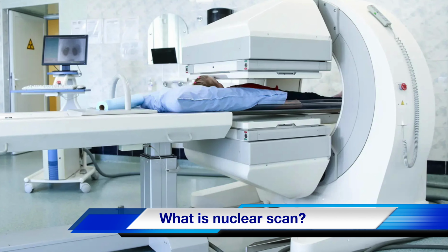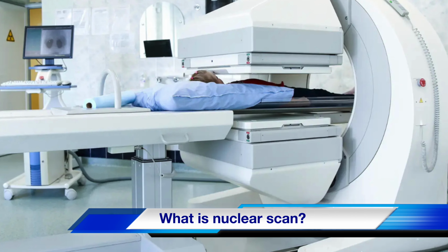Nuclear scans are based upon the principle that if we inject a dye which has a very minuscule, quote unquote, trace amount of a radioactive compound which is taken up by the thyroid gland, it will get concentrated there, and the emission of this radioactivity will be read by the detectors. We can identify whether the thyroid gland is there or not, whether it's working more or not, whether the whole gland is working more or a part of the thyroid gland works more.